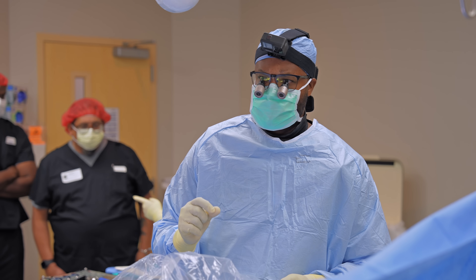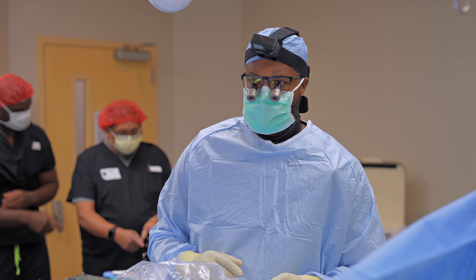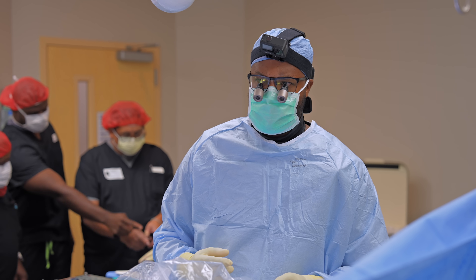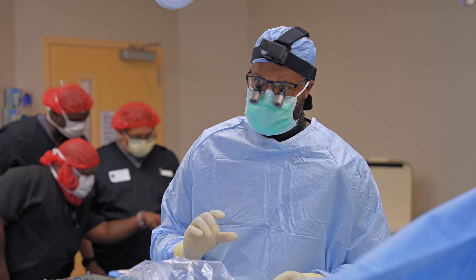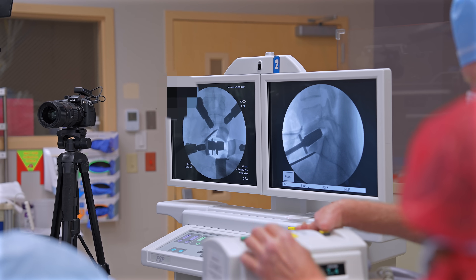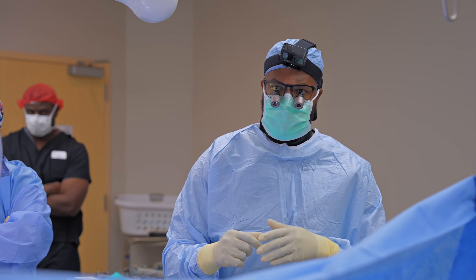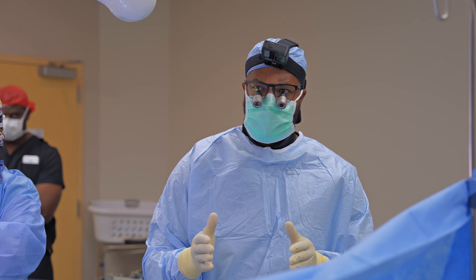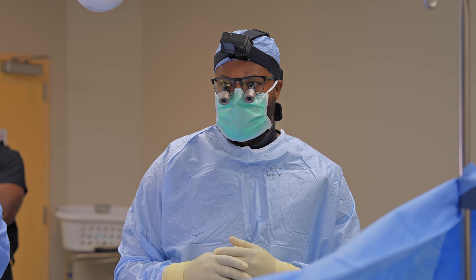She has pretty severe collapse and bone on bone. I always counsel patients about the possibility of a fusion if I get in there and it's too collapsed down — hers is kind of right on the edge. So right now we're making sure that this implant trial — that's just a temporary one — is right down the middle. That's what the implant needs to be for the disc replacement to work effectively.